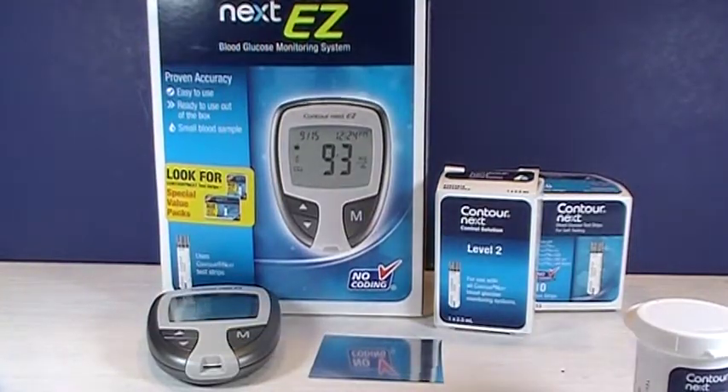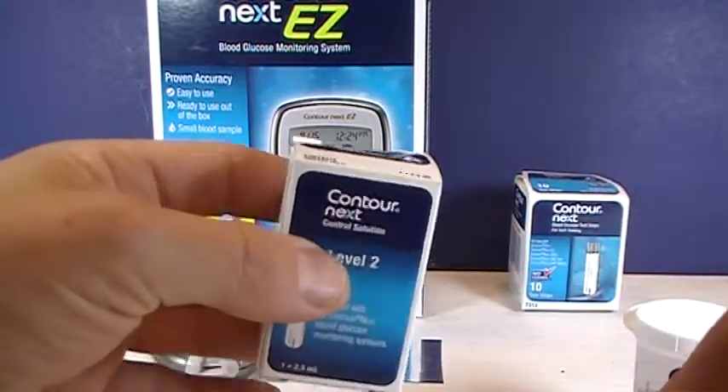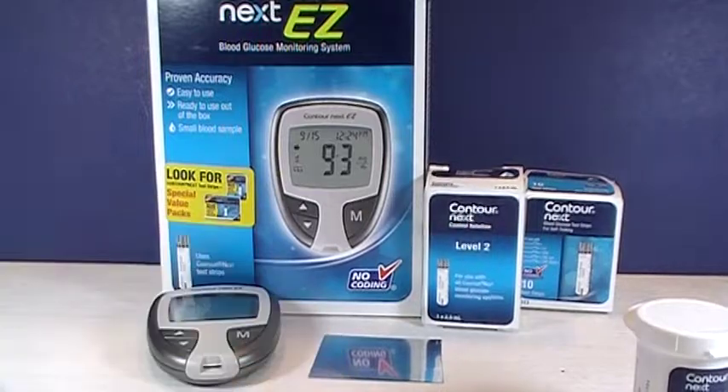But with the Contour Next EZ, you're going to want to make sure that you get Contour Next solution. There are lots of different control solutions out there. You want to get the one specific to the manufacturer that you're using.